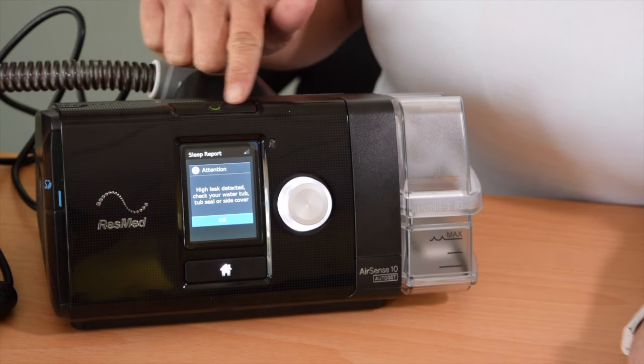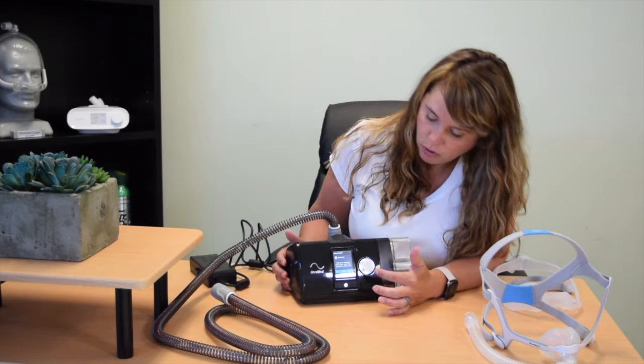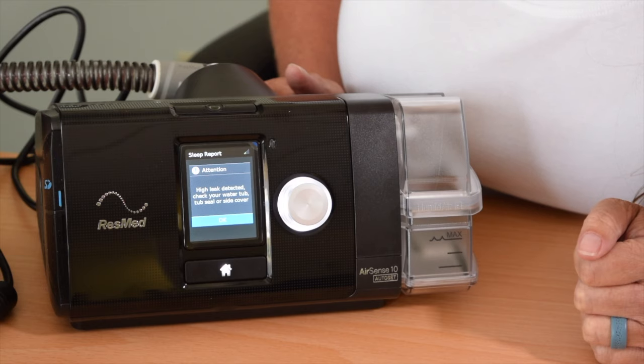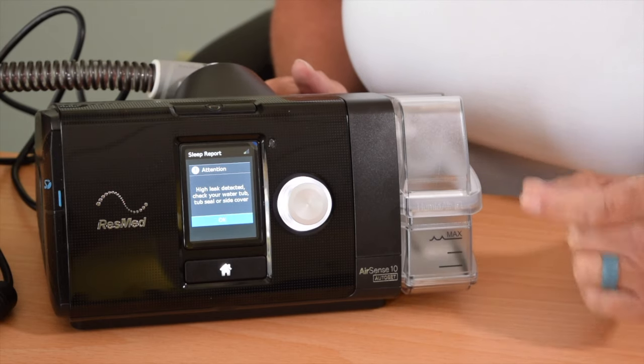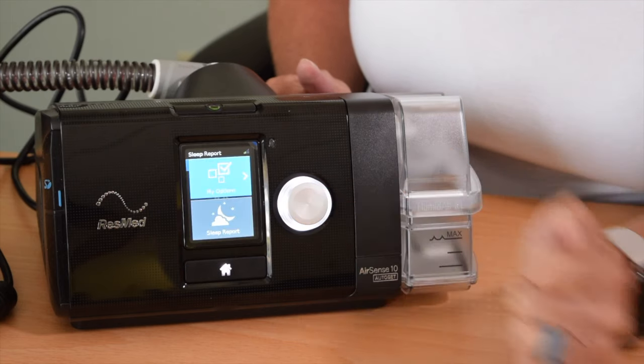If you were to try to start your therapy, you're going to see that you can't start the machine — it will not start, it doesn't matter how many times you press it. You have to acknowledge the attention. Regardless of what it says, you have to acknowledge that you saw it or the machine will never turn back on. It says 'high leak detected, check your water tub.' So I'm going to acknowledge it and then fix the problem.